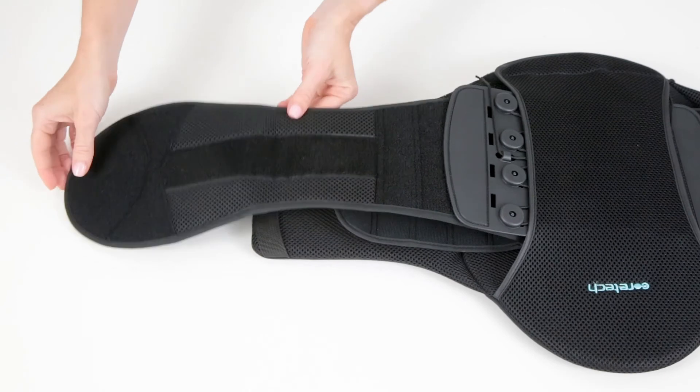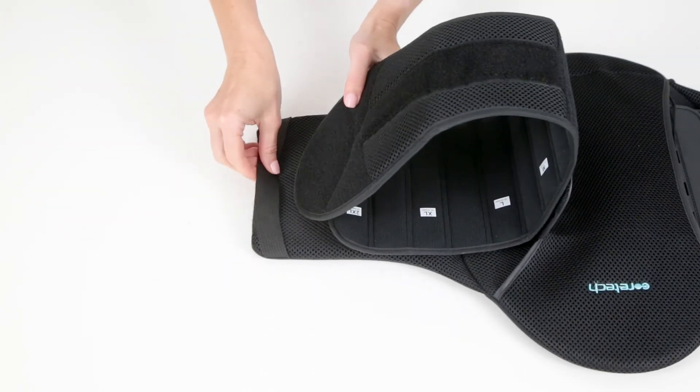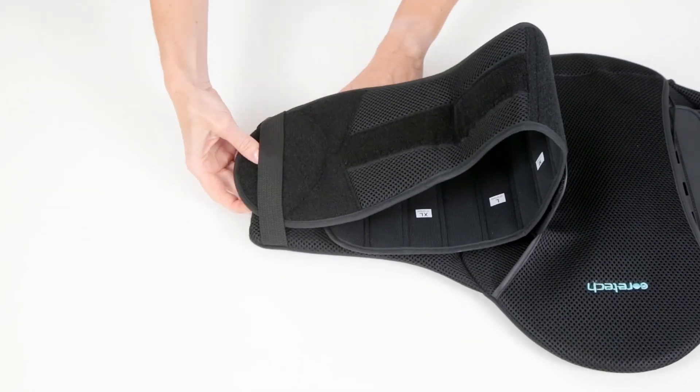The side panels have a strap to help keep the straps in place.